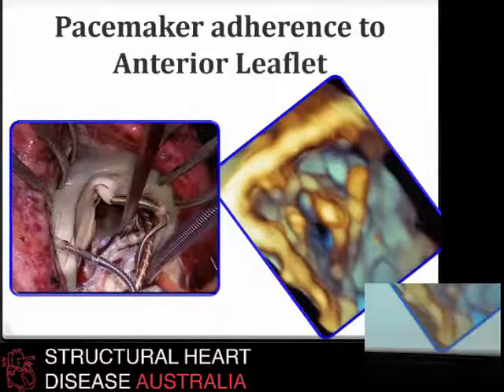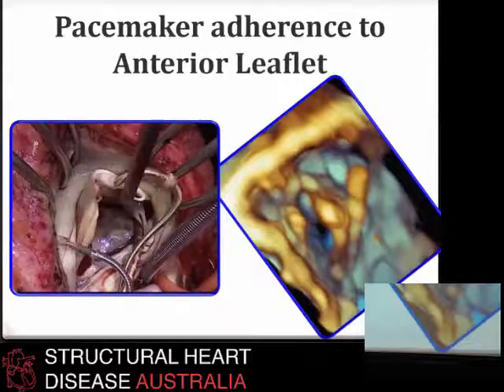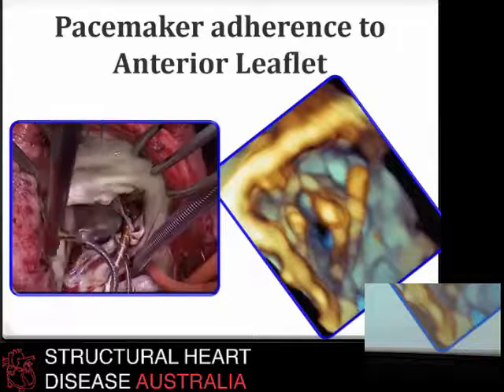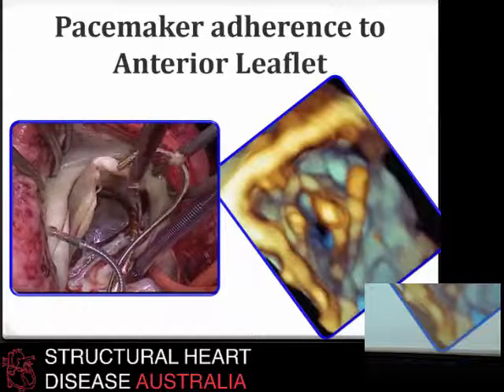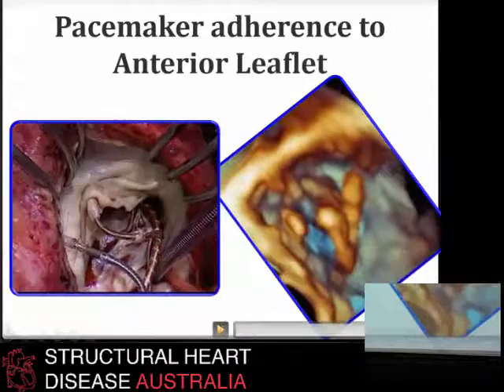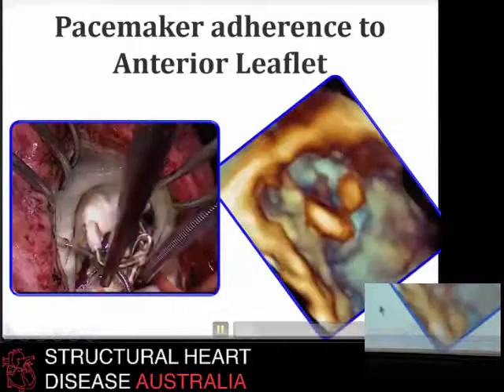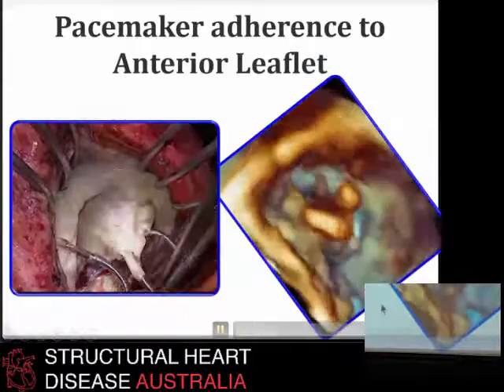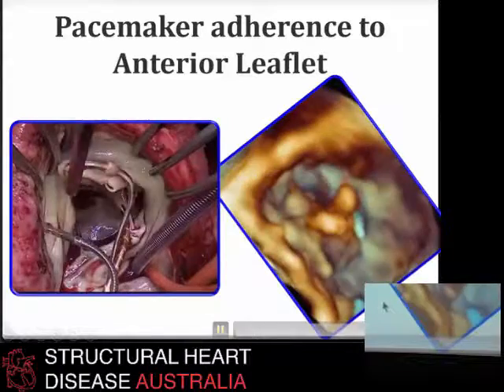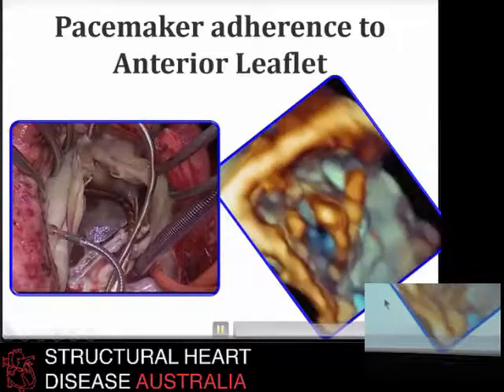This video shows a case of pacing lead adherence to the anterior tricuspid leaflet. And on the right you can see a 3D image of the anterior leaflet affected by the pacing lead.